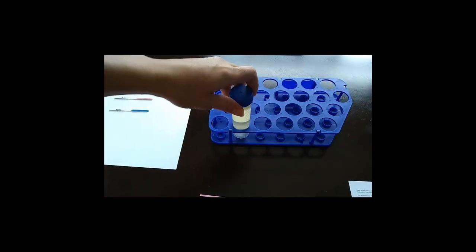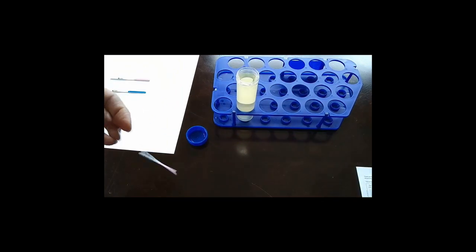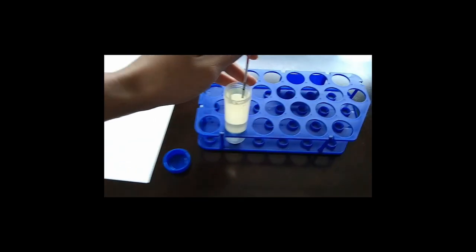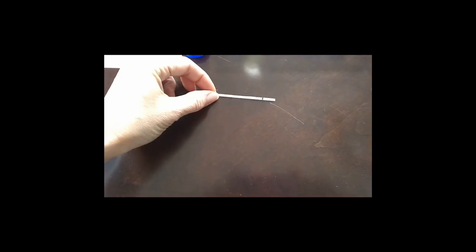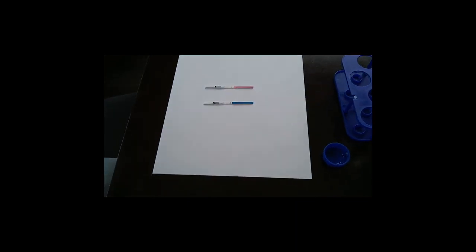So to take a test, what you're going to do is collect your first morning urine. You're going to dip the strip into the urine for 5 seconds. And then you're going to lay it flat on a non-absorbent surface and let it develop for 15 minutes. So I've already done this.